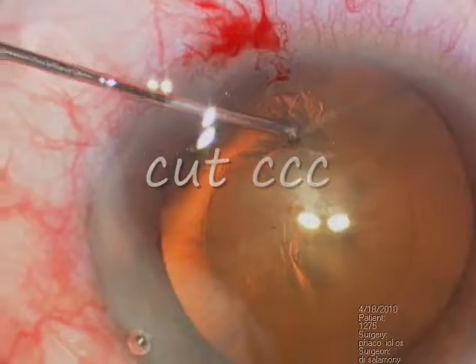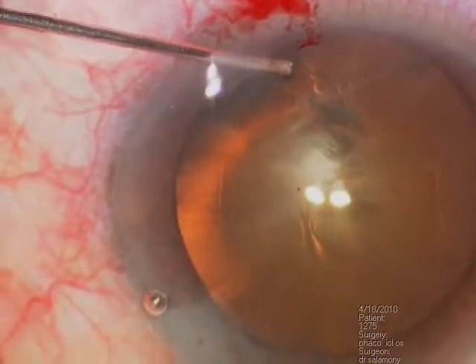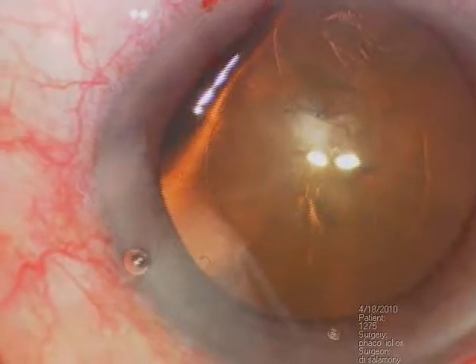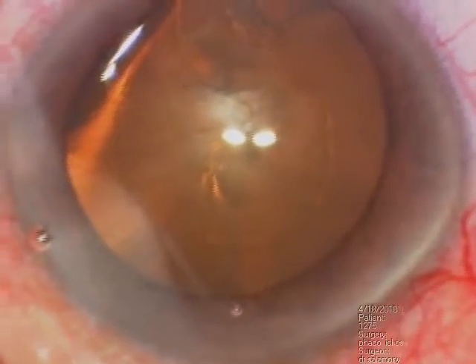This is capsulorhexis. At this point it is cut. As you see here, I removed the cystotome. At this point I decided to complete phaco.